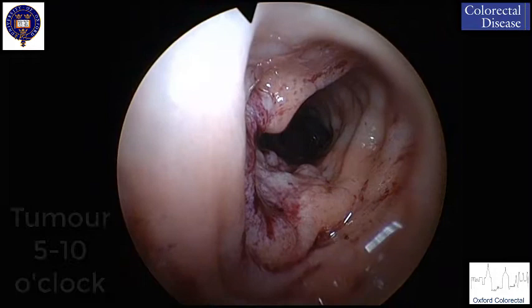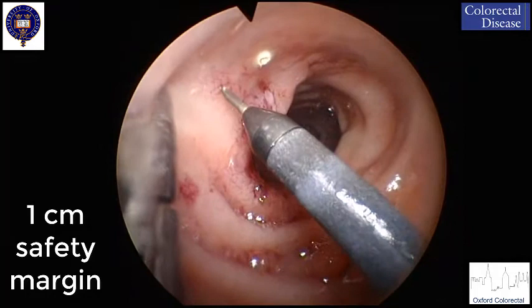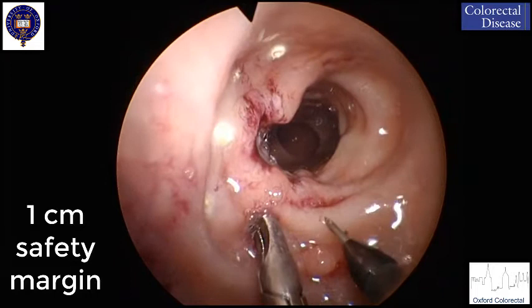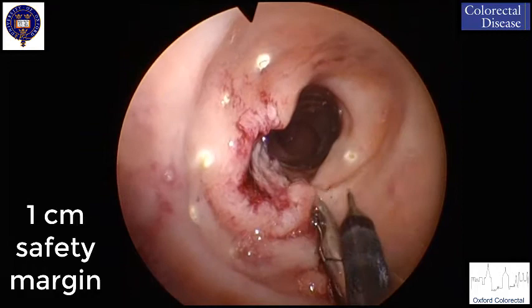The patient was in prone position before the TEM kit was installed and scope centralized on the residual cancer tissue visible in between 5 and 10 o'clock position. It is advisable to abide by a 1 cm safety margin, even for benign lesions, as has been shown that up to 31% of cases have a focus of associated malignancy.